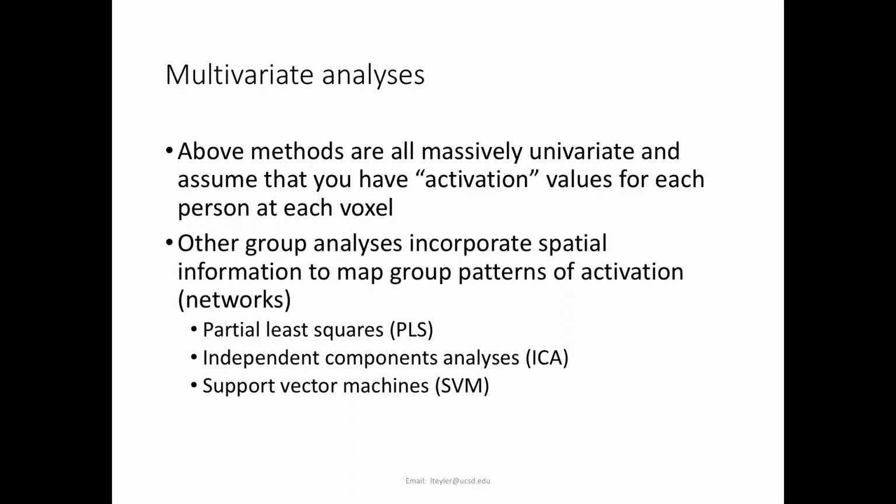Now we're going to be talking about functional connectivity, which is one way of looking at networks, but this is really more about looking to see whether the same places light up. This is a very colloquial way of saying it. Do the same places light up within a group, and does another group have another pattern of places that lit up?